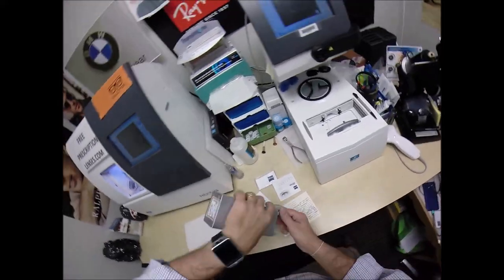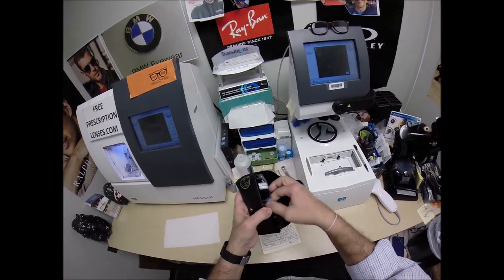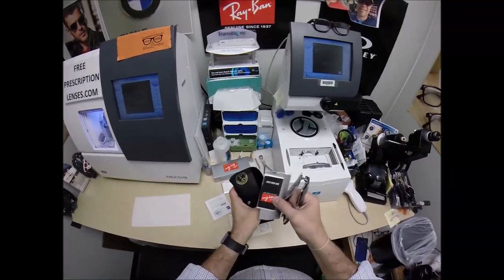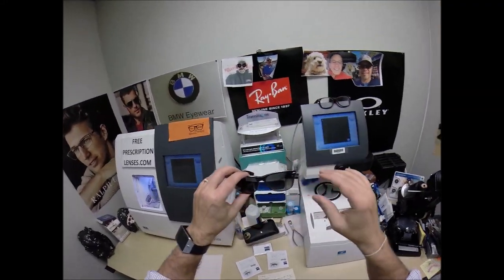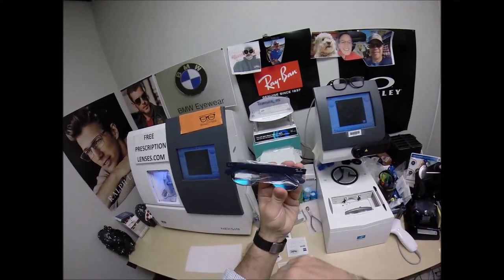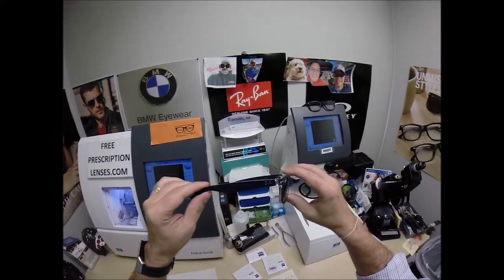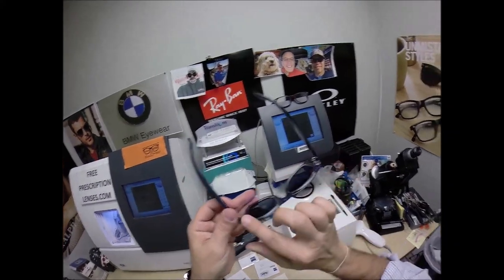I'm going to take everything out of the original packaging as Ray-Ban sends it to me: your Italian leather Ray-Ban case, your Ray-Ban frame, and a cleaning cloth with junk mail. This is color 6053, the blue crystal — matte blue front with crystal on the inside.